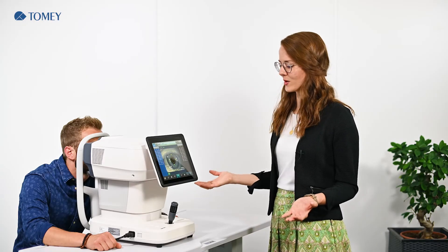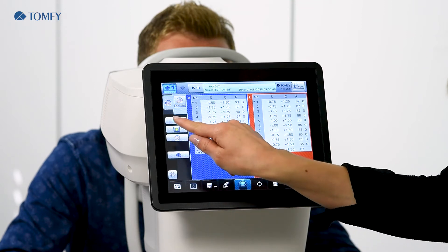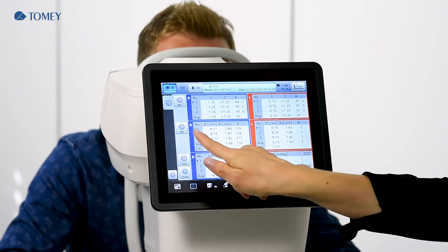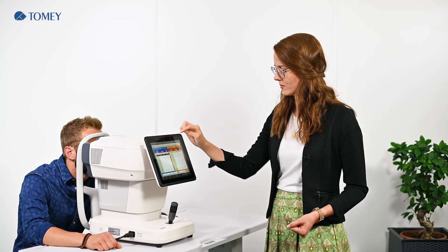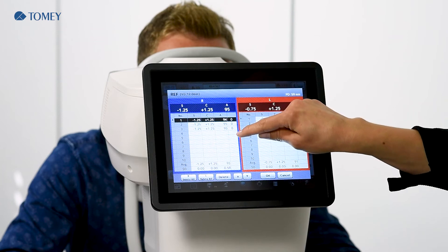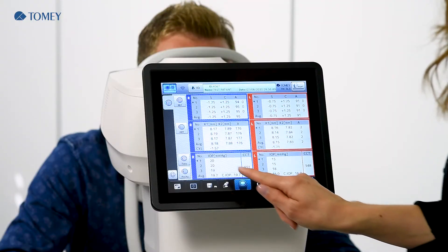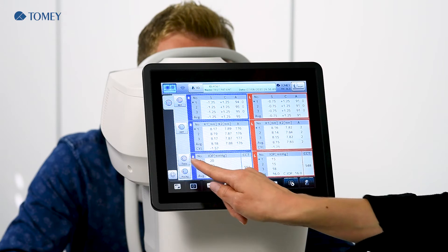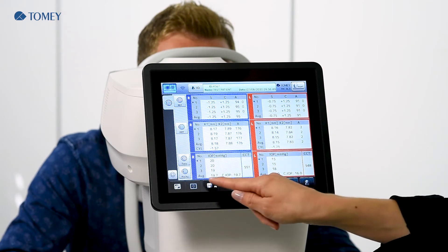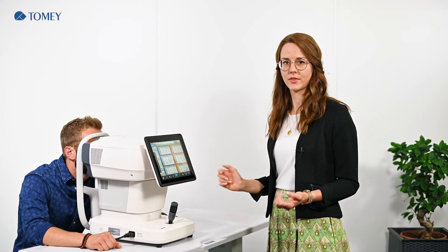All measurements are done. We can go into the analysis by tapping the analyzing button. Here are the normal refraction values and also the keratometer values. You can easily tap into the number of measurements and in the last row you see the reliability of the measurement — in this case it is zero, and zero is the best reliability. Worse would be number nine, and an E would be an error message. Same applies to keratometry. In the tonometry view, we have three measurements and in the bottom line you see the corrected IOP value, which takes the central corneal thickness into account.